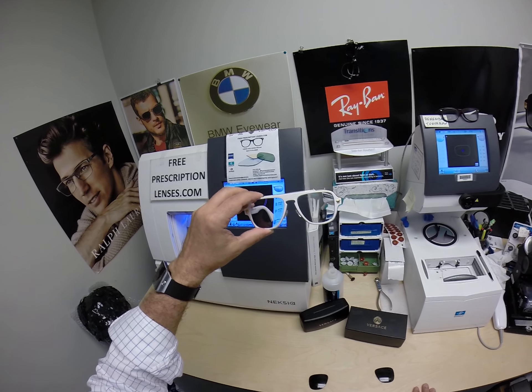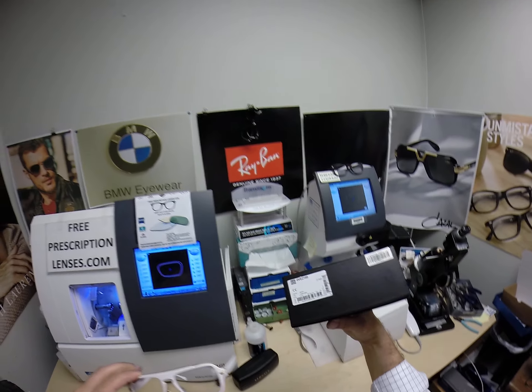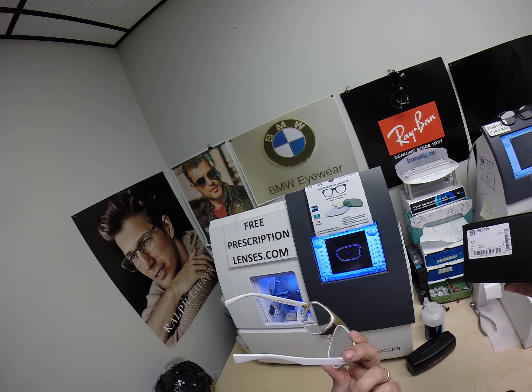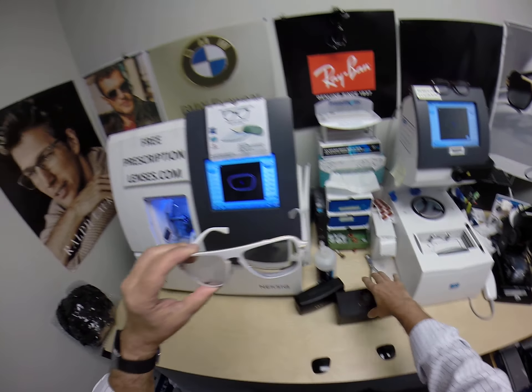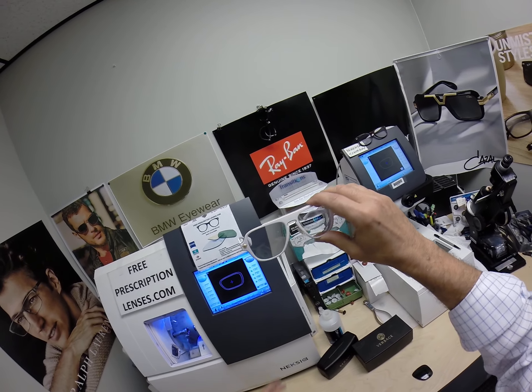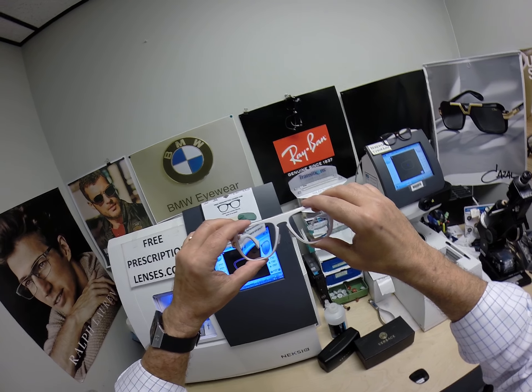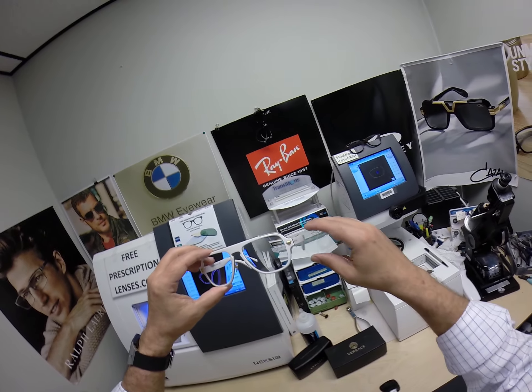Now he lives in Des Moines, Washington. He is getting the Versace 2199 color 1002. It only comes in one size — the 56 eye size — and comes in a few colors. This frame sells for around $290, again with one free pair of lenses. But he got the Zeiss Photofusion extra gray with the gold flash mirror.